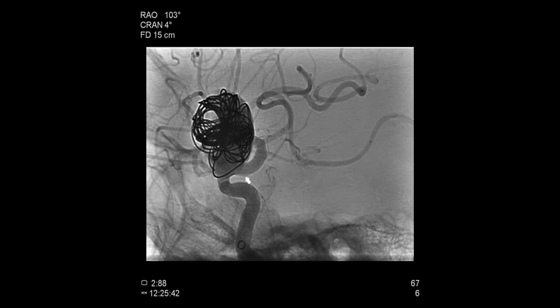The static imaging showing before the deployment, and then how after deployment it doesn't open up at the bend. Microcatheter now in it helps to start opening it, and then the wire tug given to open it at the bend. Now this image shows where it is not really well opposed to the wall. There is a small gap.